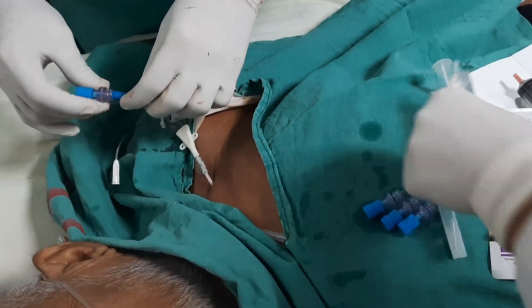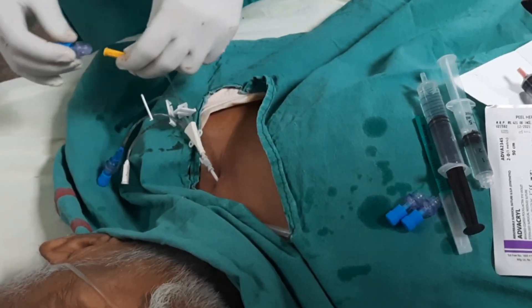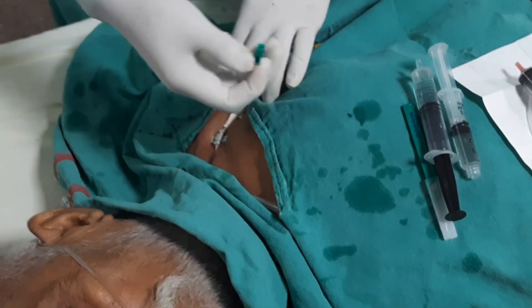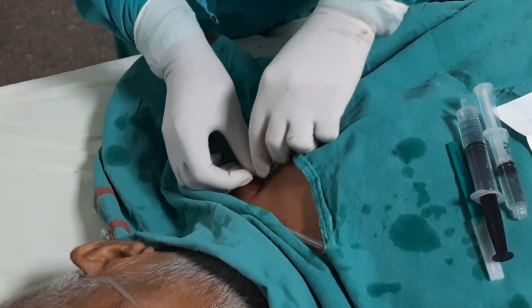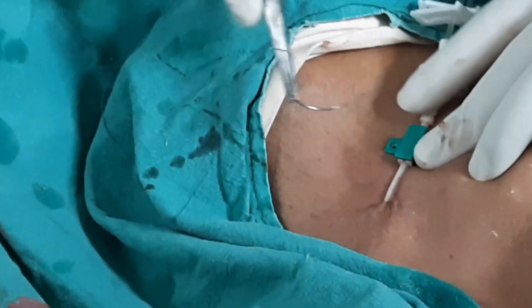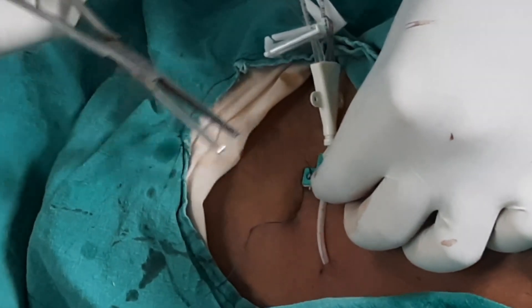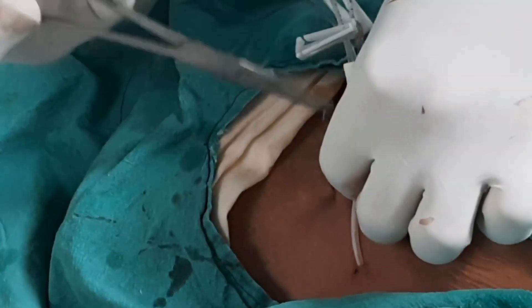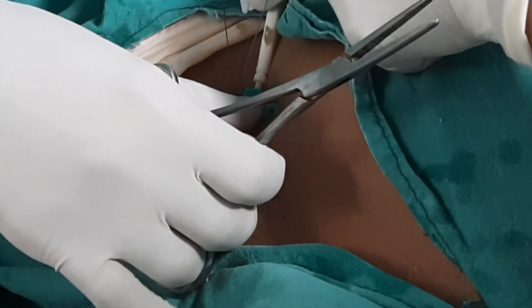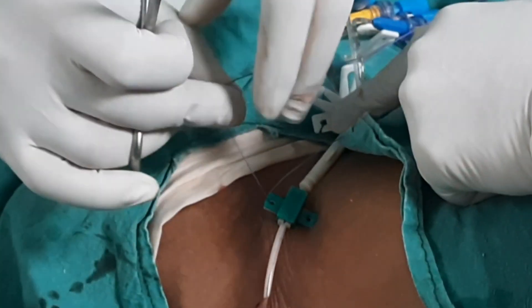Now we will fix the caps to each port of the central line. The same cap can fit in any port. After that, we will place the butterfly cap on the central line. Before suturing, we check all port patency one more time. This is how we suture it, and after suturing we have to stick a plaster.